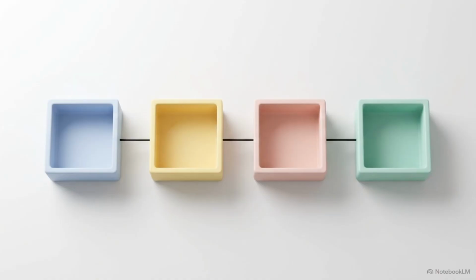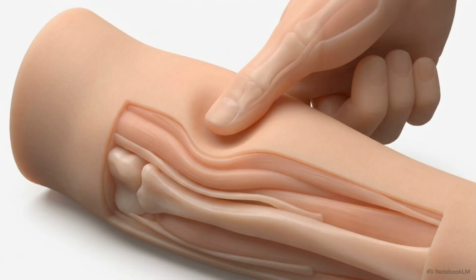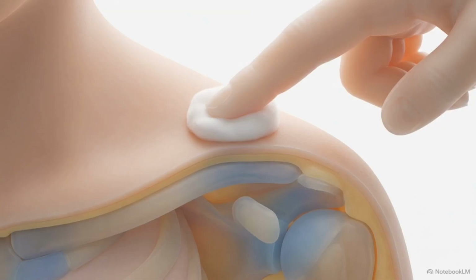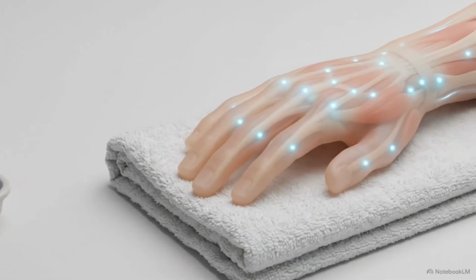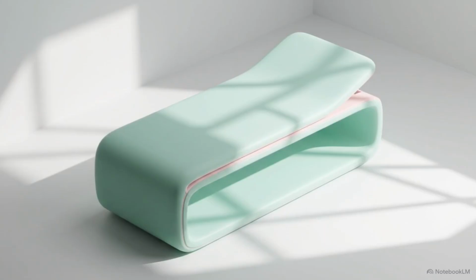Mastery of this process involves a sequence of technical steps: establishing mental focus, locating the point accurately, applying the correct depth and angle, and concluding with a safe withdrawal. Once the needles are removed, the patient should remain quiet and relaxed. This period of rest allows the body to settle and respond to the regulatory changes made during the treatment.